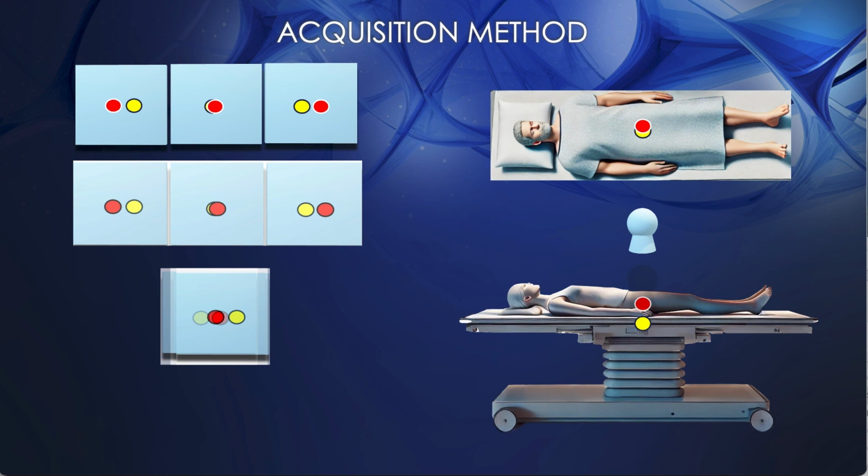And that's the magic of digital tomosynthesis, it's a bit like a limited angle CT. You get slices through the entire patient, but you do not completely remove the objects that are above and below the imaging plane. And those objects are often referred to as structural noise. So it gets blurred away, not entirely, but enough that the resulting images are quite useful.